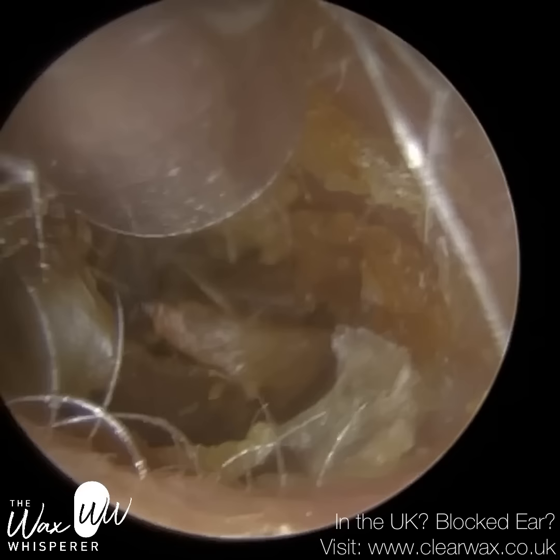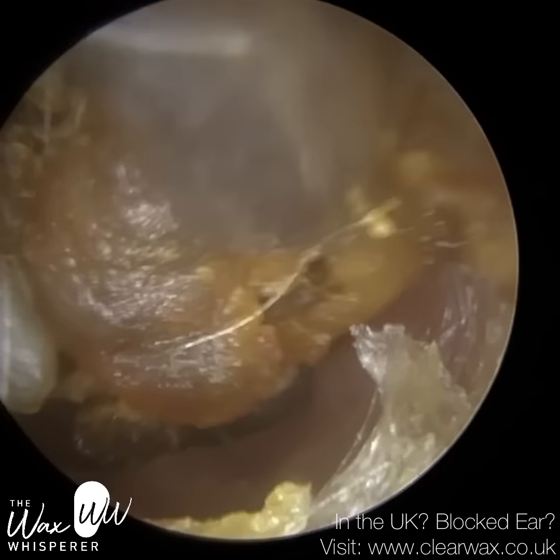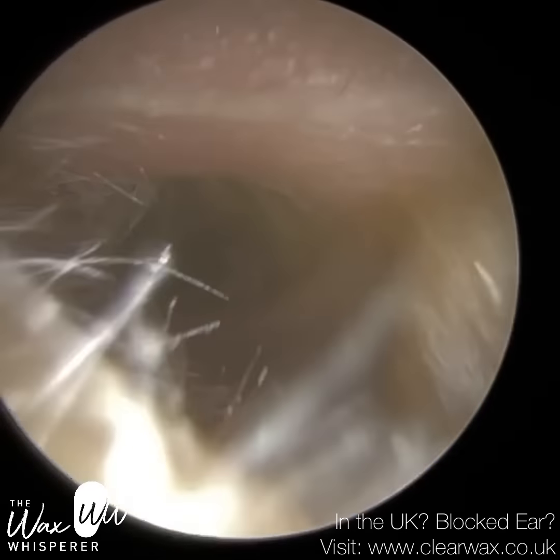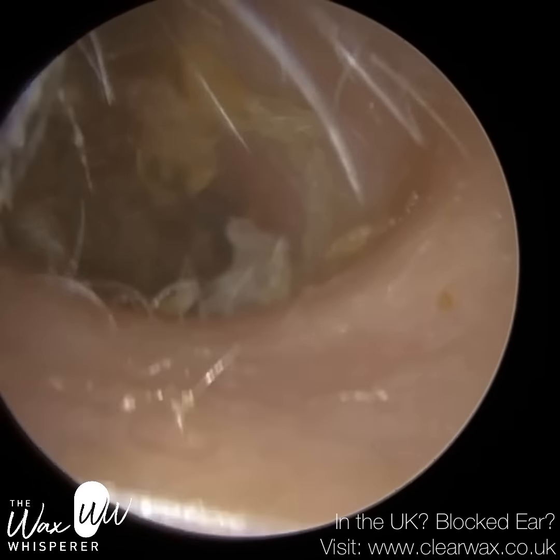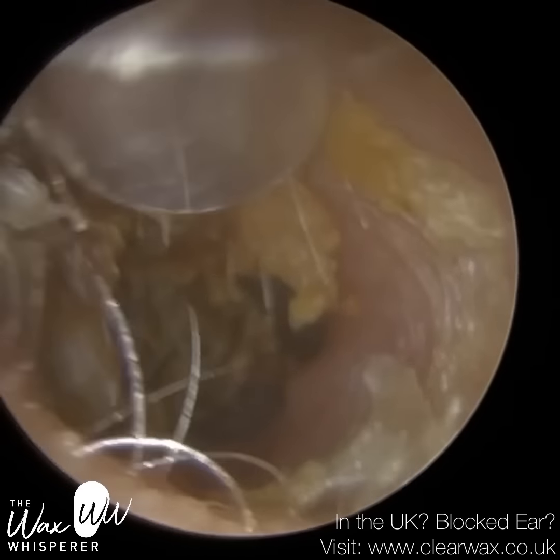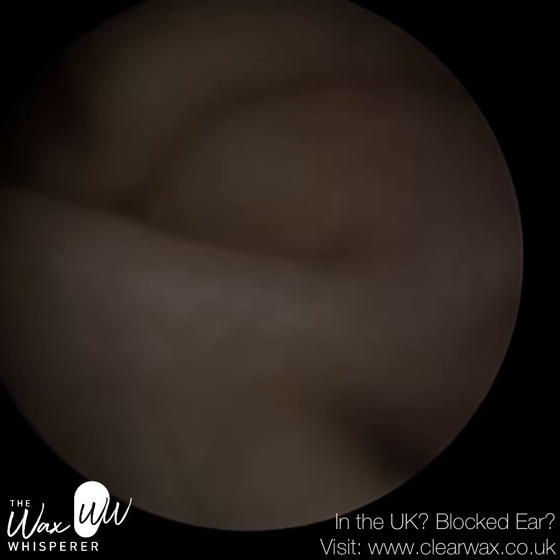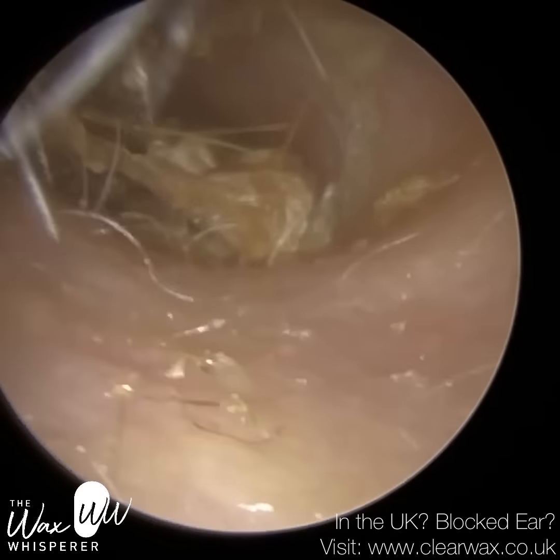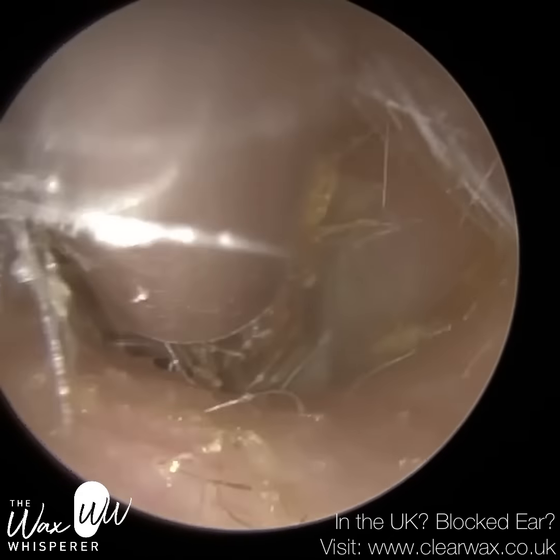So just working probably mid-canal now, just past the second bend, and you can see these little balls of dead skin. They are quite loose at the moment, but there is some dead skin still adhered to the ear canal, which we're going to peel away a bit later. And I'm slowly but surely just bringing all this skin away. Now, the majority of this skin would naturally migrate out of the ear by itself.